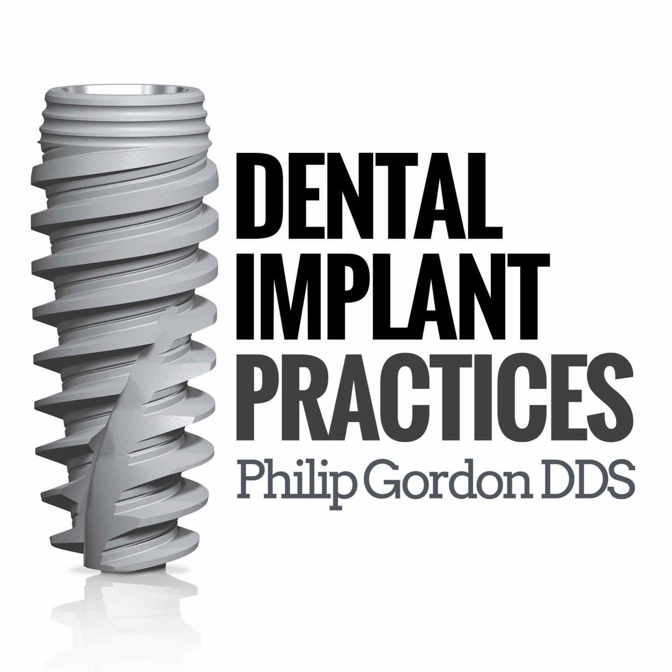So the patient comes in, let's say, for replacement of their missing teeth 28, 29, and 30. And right up on the screen, I show them where the implants need to go and show them the difference between doing 3 individual implants with 3 individual crowns versus doing a 3-unit bridge on 2 implants.